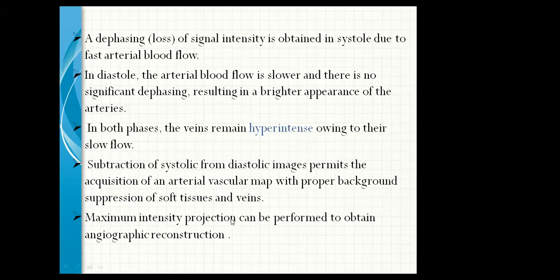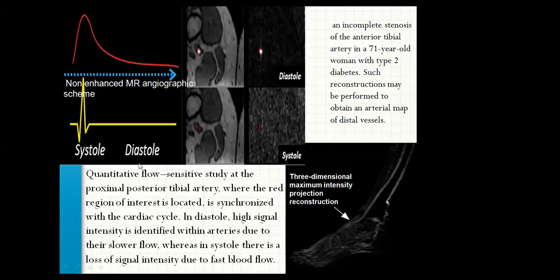Maximum intensity projection can be performed to obtain an angiographic reconstruction. This is a non-enhanced MR angiographic scheme showing a quantitative flow-sensitive study of the proximal posterior tibial artery, synchronized with the cardiac cycle. In diastole, high signal intensity is identified within the artery due to slow flow, whereas in systole there is a loss of signal intensity due to fast flow. This three-dimensional maximum intensity projection reconstruction shows an incomplete stenosis of the anterior tibial artery in a 71-year-old woman with type 2 diabetes. Such a reconstruction may be performed to obtain an arterial map of the distal vessels.